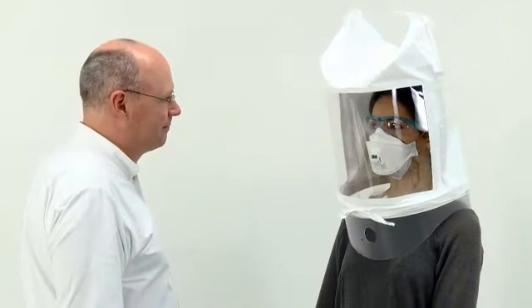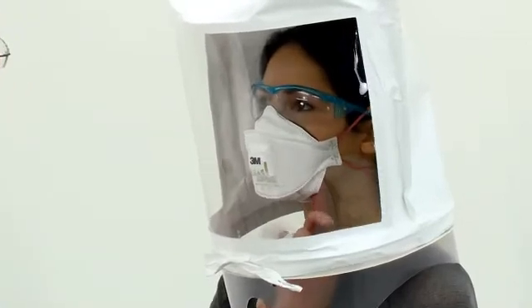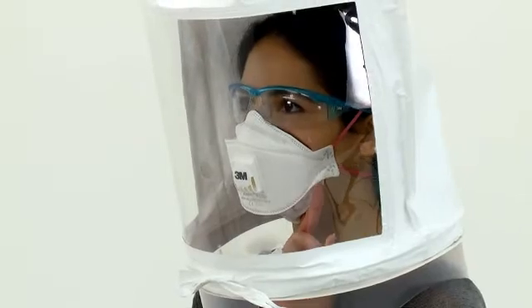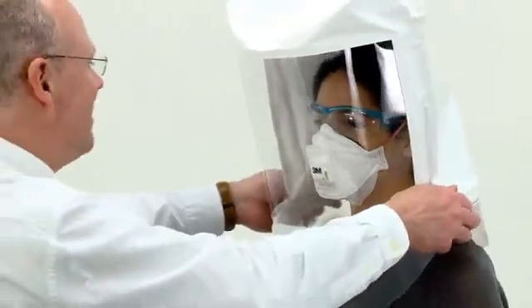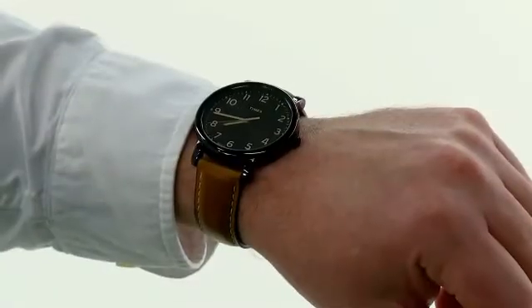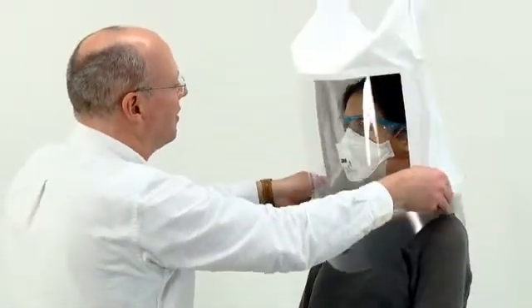Once the subject has performed all of these exercises without tasting the mist, they have passed the test. You could at this point ask the subject to reach up inside the hood and break the seal of the respirator, followed by taking a breath. By tasting the solution, the subject will gain an appreciation of the protection provided by the respirator. If at any point during the test they indicate that they can taste the mist, stop the test and remove the hood. After allowing time for the taste to clear from their mouth, repeat the sensitivity test, then have them re-fit and adjust their respirator and repeat the fit test.